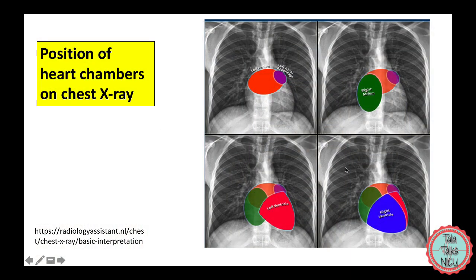Before we go anywhere, let's go over which chambers make up the silhouette of the heart on an x-ray. These are all adult x-rays, so just imagine a baby's heart to be relatively larger compared to the size of the chest. The top part of the cardiac silhouette is taken up pretty much all by the left atrium. The right side is pretty much all right atrium, and the left is mostly the left ventricle. The right ventricle ends up being this little sliver underneath.